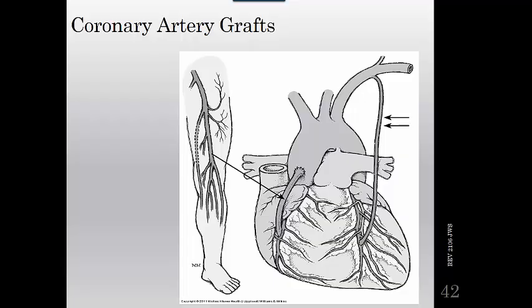So when doing a calcium artery score, which we'll talk about later, you're probably going to see stents in there, and they should be recognized so that they're not included in the images that are measured, because they'll artificially increase the score because they're not actual calcium. So that's why it's important to know what stents look like.